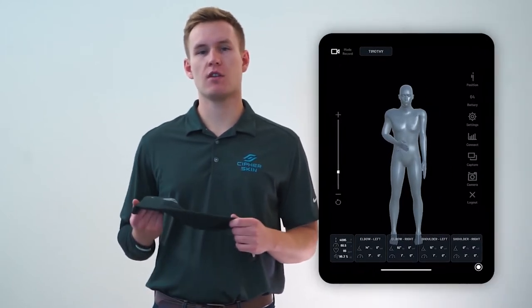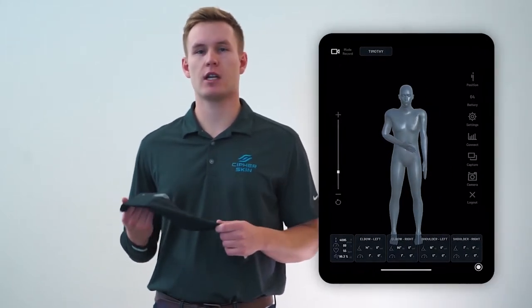The BioSleeve connects to our software application, the digital mirror, via Bluetooth and transmits data in real time. All real-time metrics are stored locally in the BioSleeve as well as in the cloud. The digital mirror translates data captured by the BioSleeve into a 3D visualization and dashboard of metrics, and can be accessed after creating an account and logging in with two-factor authentication.